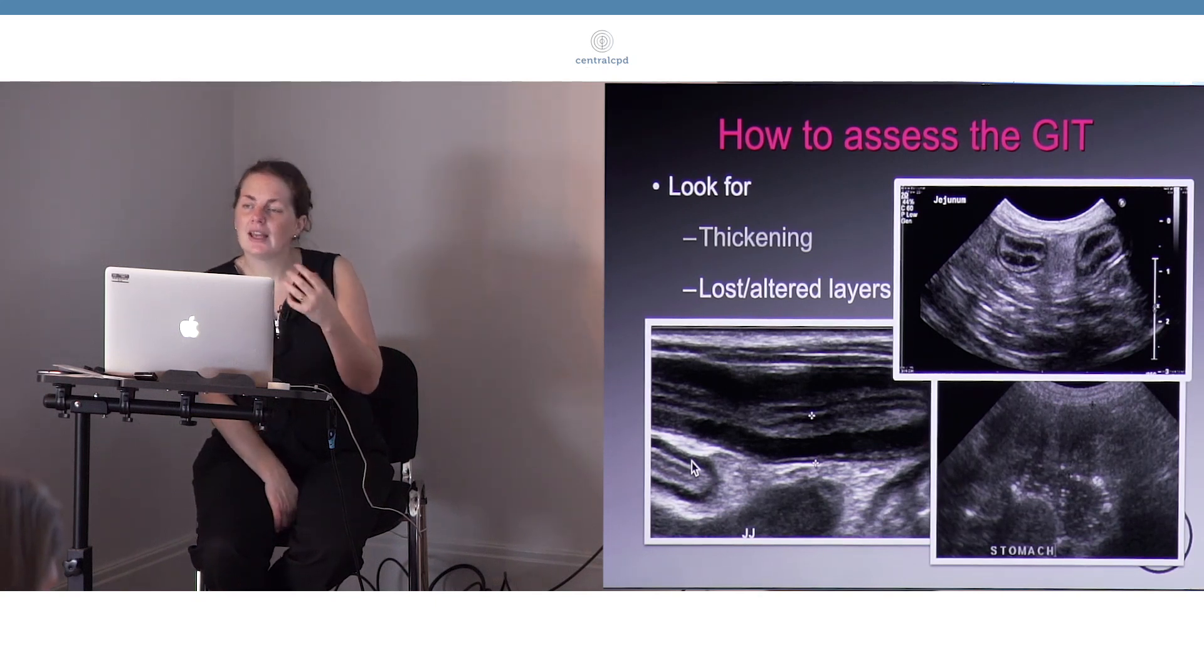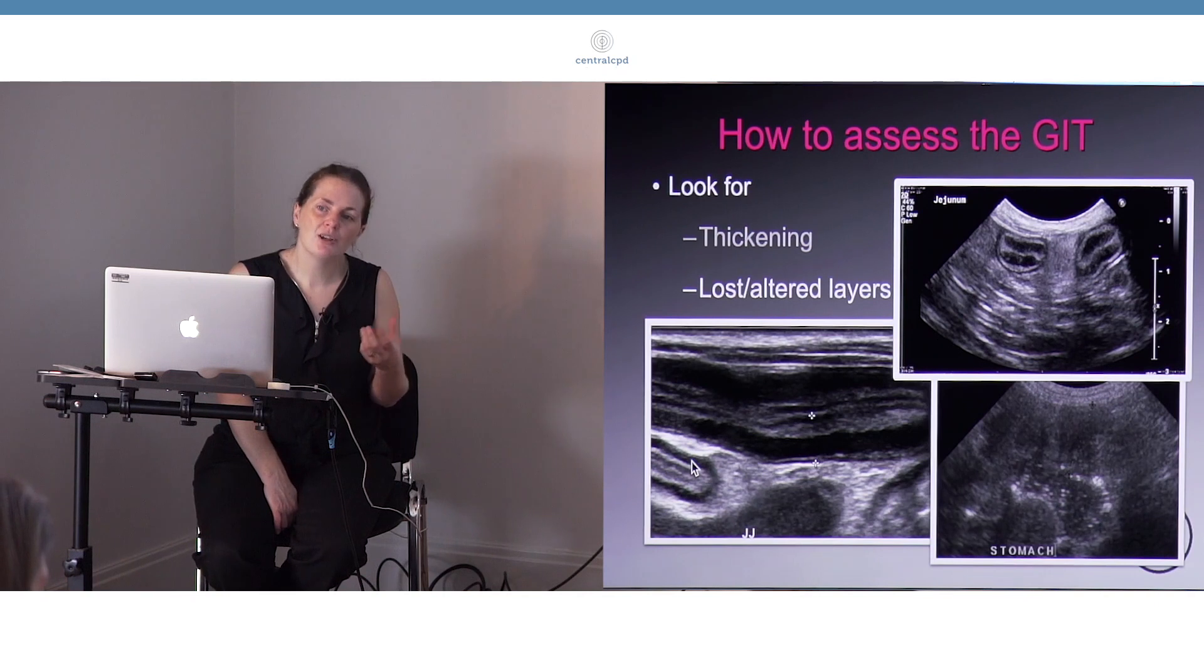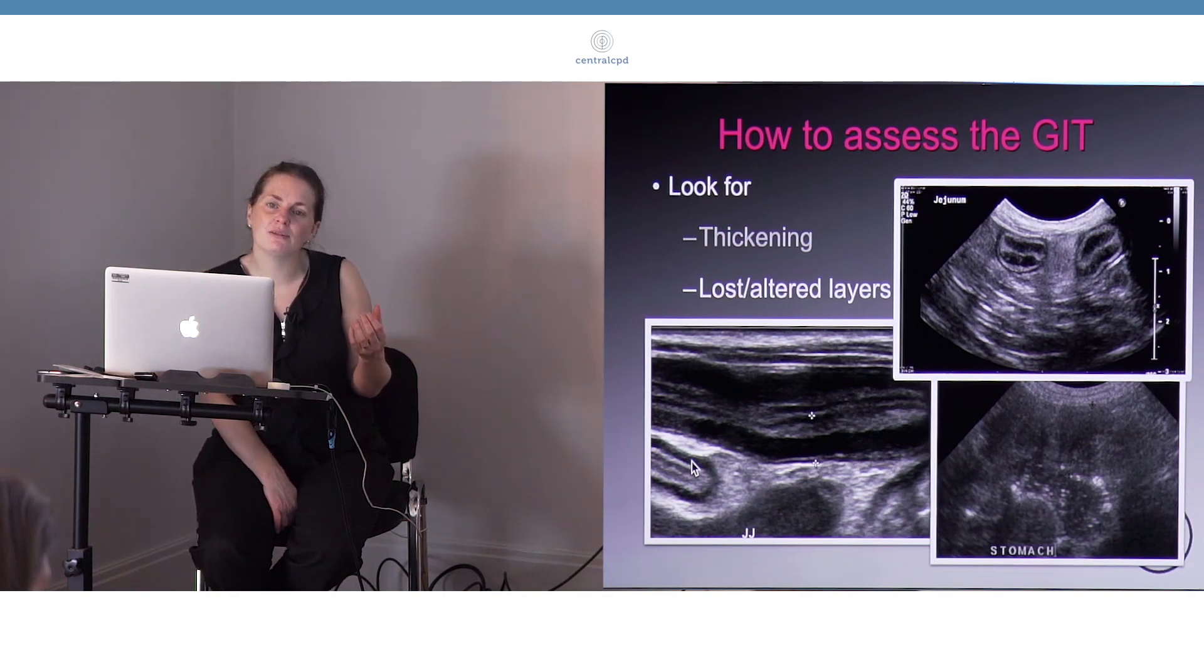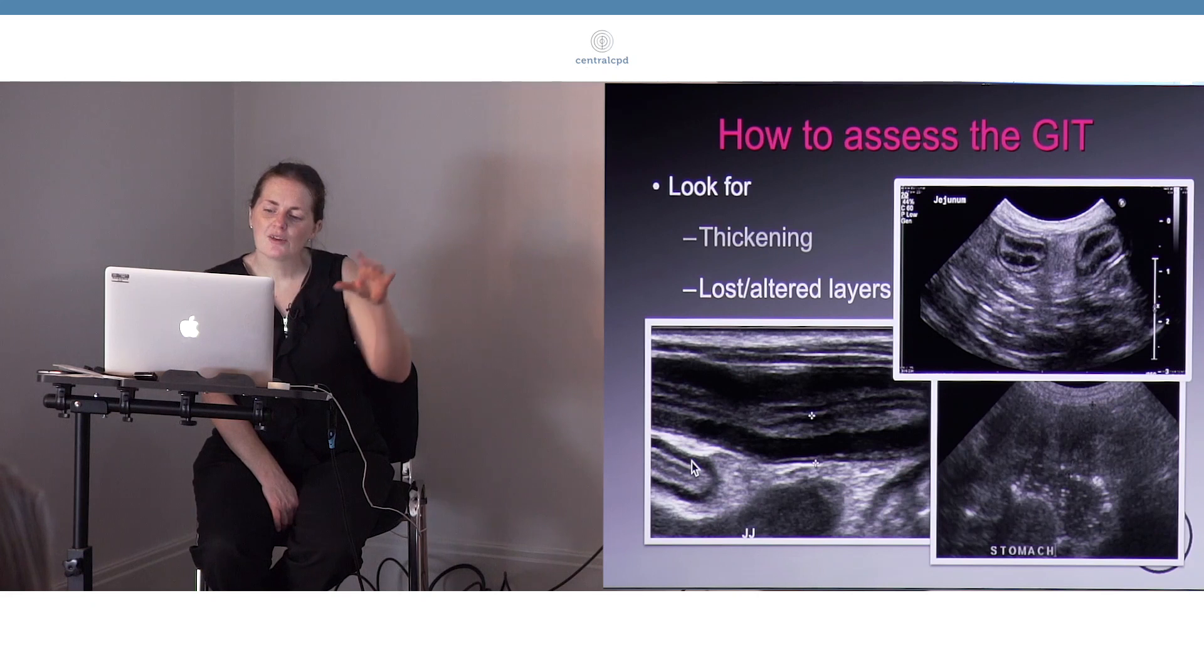But also, again particularly in cats, can be seen with lymphoma. You can see sometimes thickening of the muscularis in cases where there is muscular hypertrophy. So these patients that have pyloric stenosis because of muscular hypertrophy, or if there's a downstream obstruction, sometimes you'll see this thickening present as well.